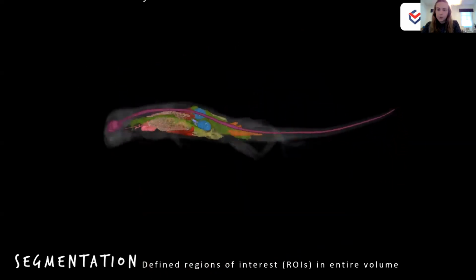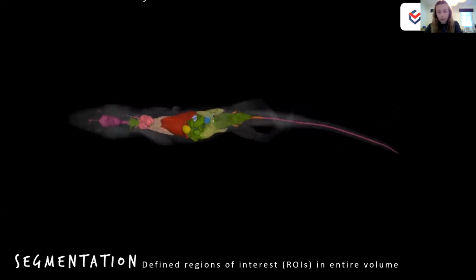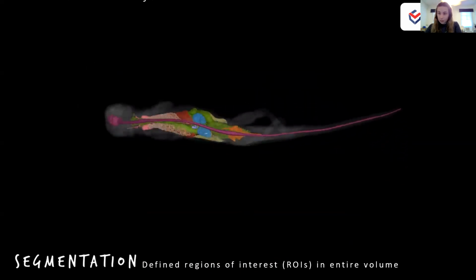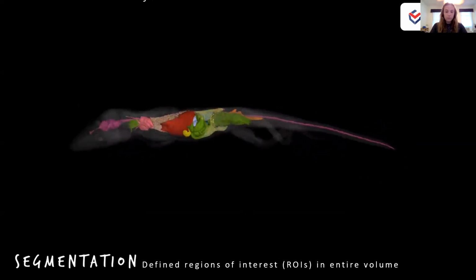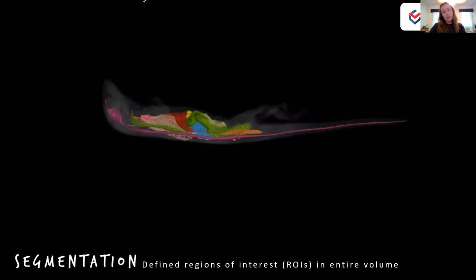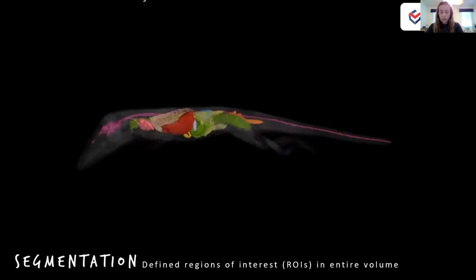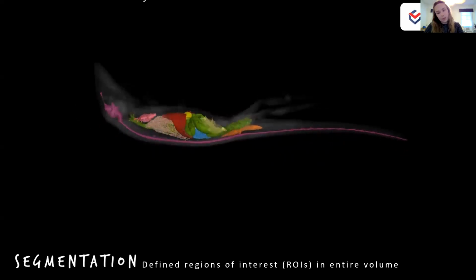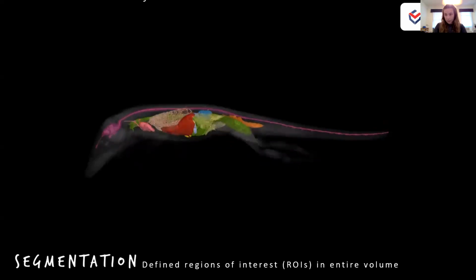So right now we are still working with our CT data sets and we're still working in VG Studio. But what we've done here is used different rendering styles for different subvolumes of CT data. But in this form, not everyone has the resources or the expertise to use these renderings and volumes to explore anatomy. So I want to convert these structures into a form that can be used by everyone for many different things. And this brings me to the next part of the process.